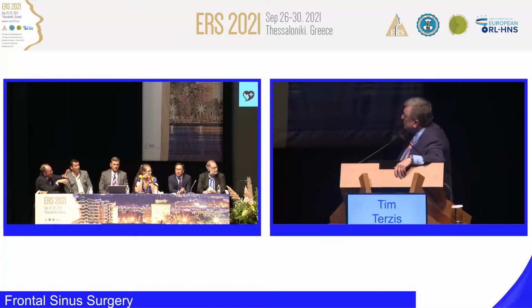There's absolutely no pathology, nothing. So having nothing, the pain more on the other side. Exactly. And what you see is just a little osteoma, no disease in the nose, nothing. I would be very conservative in this case.